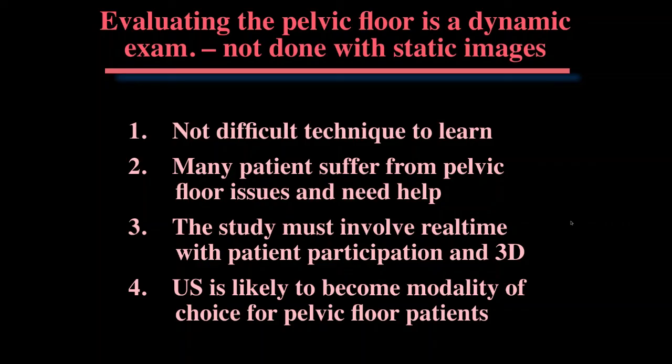Now sometimes they void, they come back in the room, they get undressed, it takes a few minutes, you get the probe, you get it dressed up. By the time you get back in there, the little bit of fluid has come into the bladder, which is fine. So we do empty the bladder and then use a little bit of fluid that's in there.